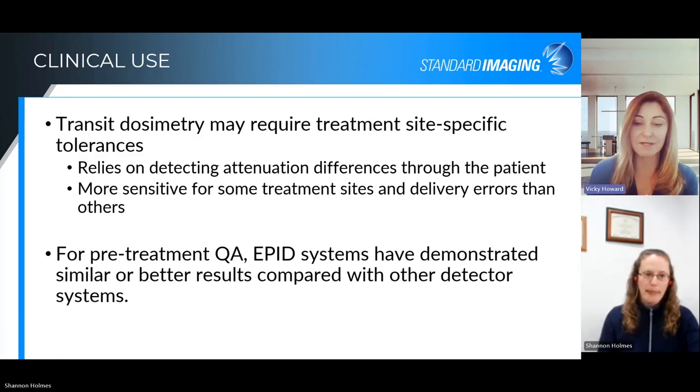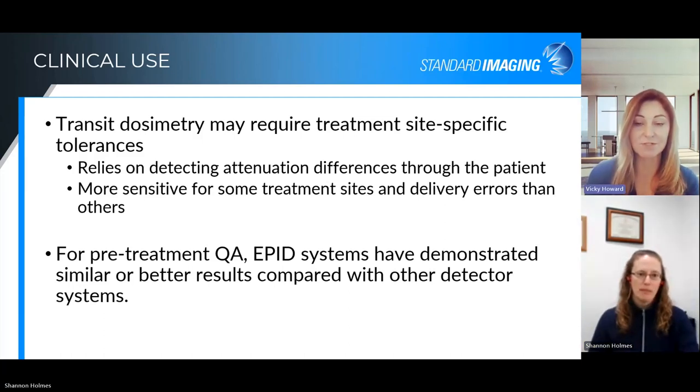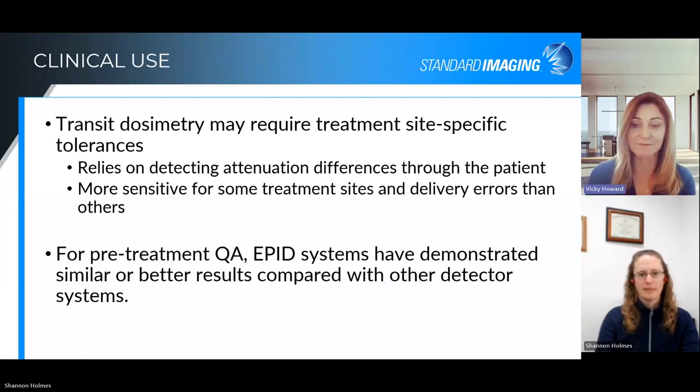Yes, definitely. It's helpful to have realistic expectations so that you're getting the most value out of this. Site-specific expectations are important, and that will be an evolution as it's being introduced into your clinic. Evaluating that should be a part of your QA program.